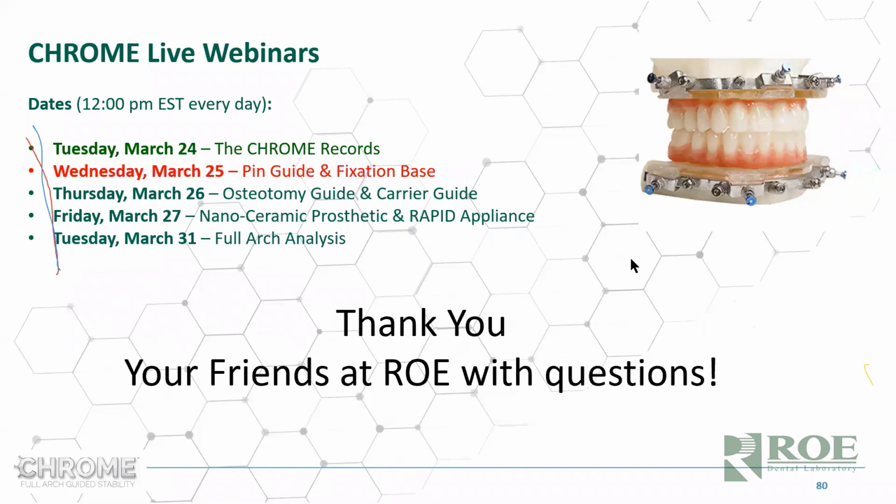If a patient is partially edentulous and has an all acrylic partial that is fitting well, were you saying you can or cannot use that to do a dual scan with radiographic markers like you did with an edentulous patient? Okay, that depends on the size of the flipper. If the flipper is 3 teeth or 4 teeth, you don't need to. Take the flipper out and just take conventional records as if you're doing dentate. If the flipper is not holding the bite up, if it's holding the bite up, then use it as a study model.